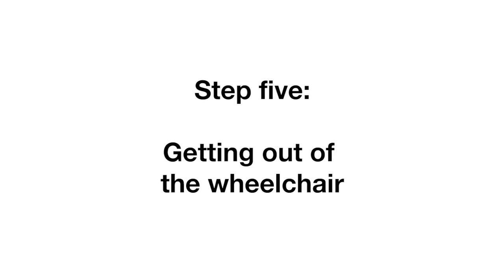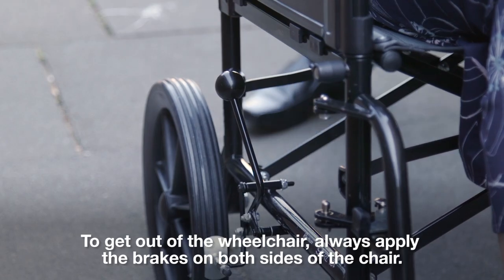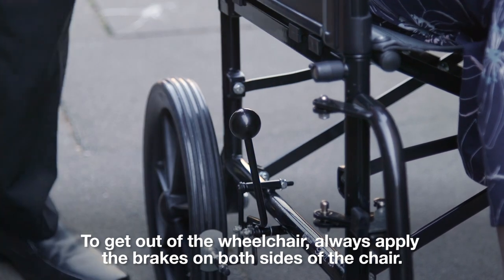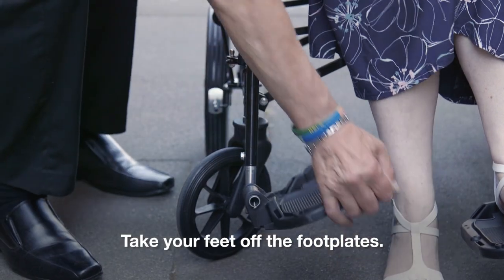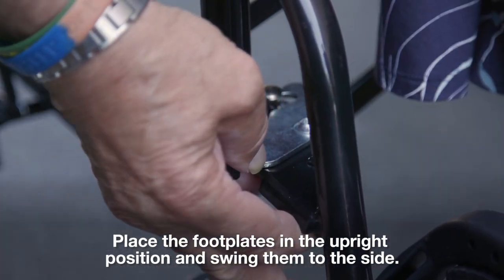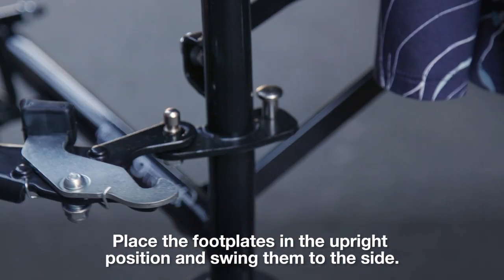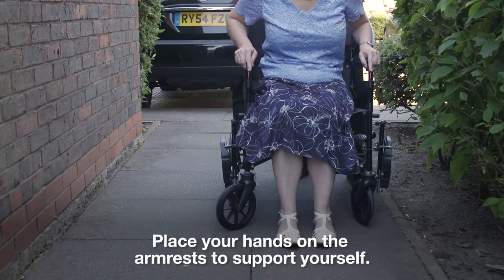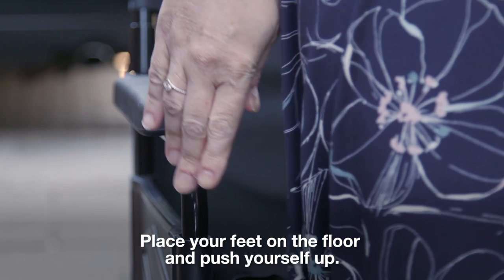Step 5, getting out of the wheelchair. To get out of the wheelchair, always apply the brakes on both sides of the chair. Take your feet off the footplates. Place the footplates in the upright position and swing them to the side. Place your hands on the armrest to support yourself. Place your feet on the floor and push yourself up.